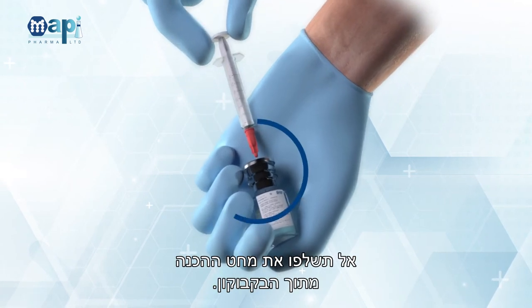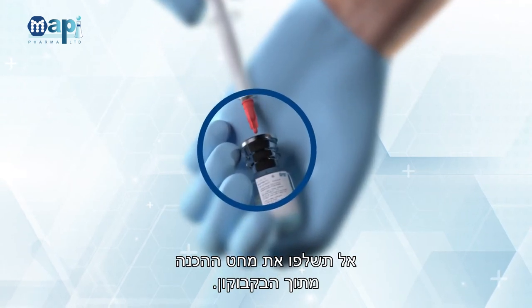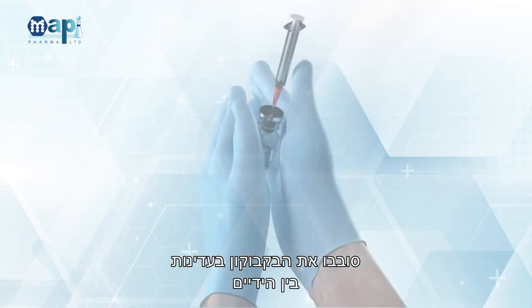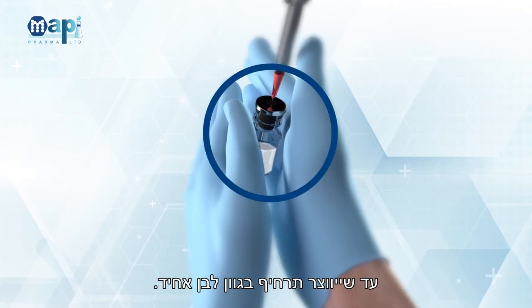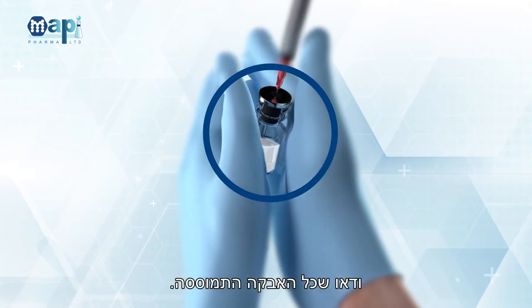Do not withdraw the suspension needle from the vial. Gently rotate the vial between your hands until a homogenous white suspension is formed. Make sure all powder is suspended.